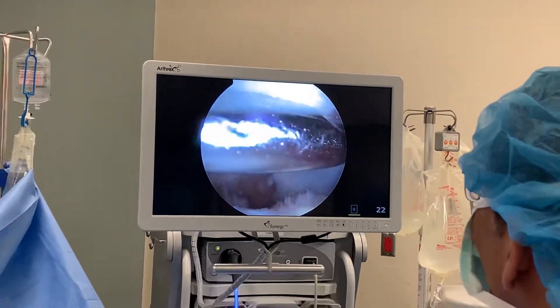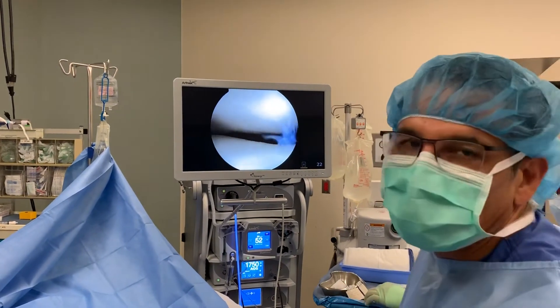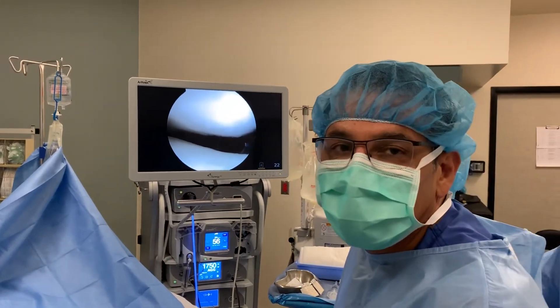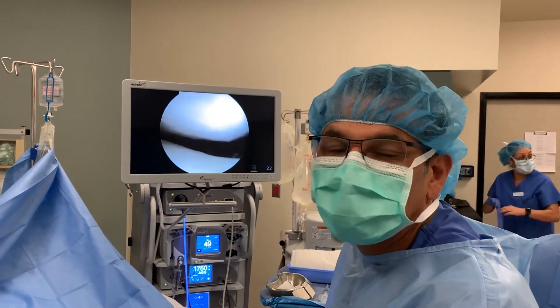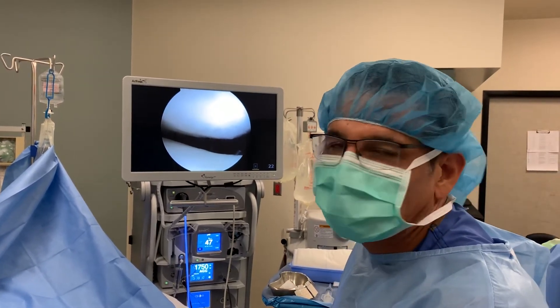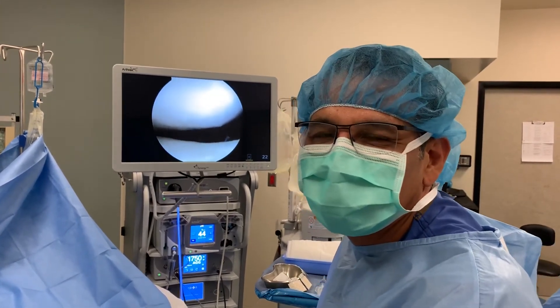Alright Nick, thank you so much for being such a great sport. I'm glad we figured your problem out. But once again, I just wanted to show you how local anesthesia can be done for a knee arthroscopy. If you're interested in learning how to do it, go to YouTube — I've done a video showing the details. There are many details involved; you have to have a patient doctor and a patient that's cooperative and able to relax.